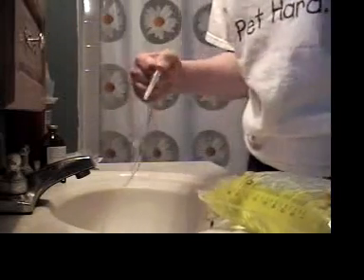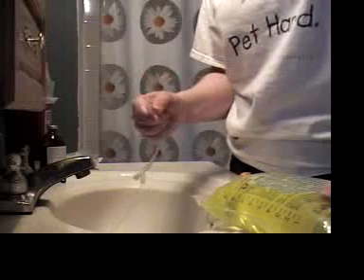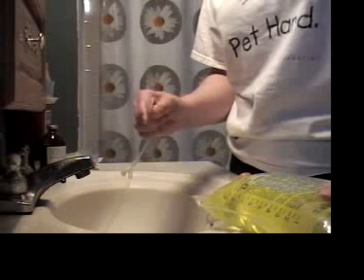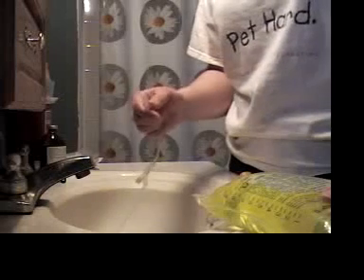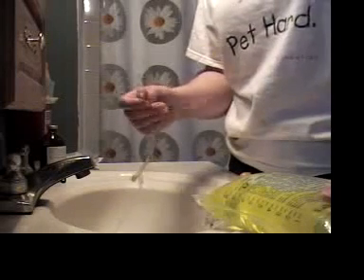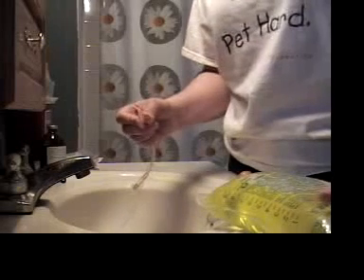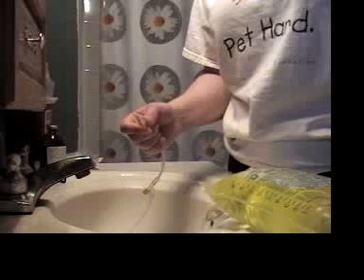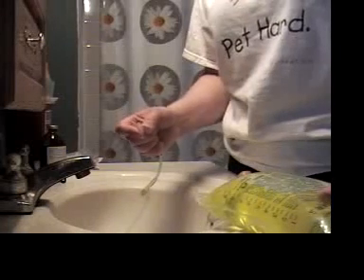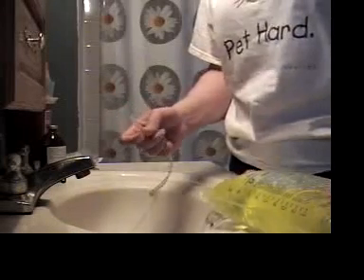I always keep a clean needle on the end of the line. Some people leave a dirty needle on the end of the line and then just change it each time. I prefer to keep a clean needle on the line just so I don't have any risk of any bacteria from the needle climbing back up the line and contaminating my fluids. But I would advise you to always do the same thing, whether it's a dirty needle or a clean needle. Always do it the same way so that it becomes habit and you don't have to worry about using a dirty needle again on your cat.